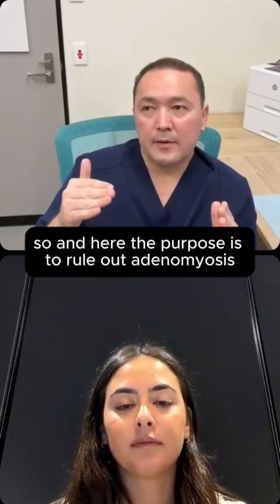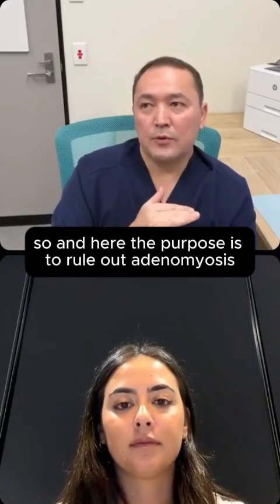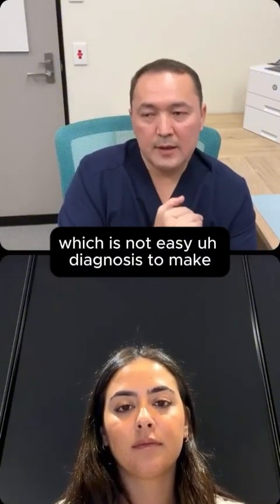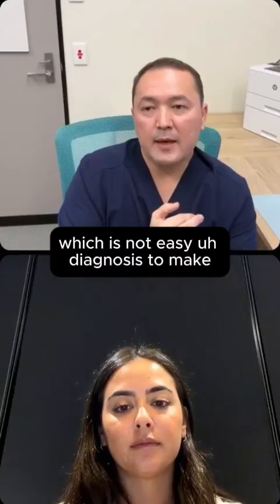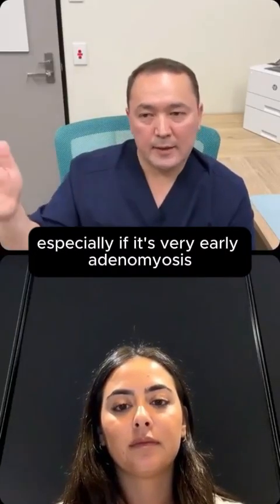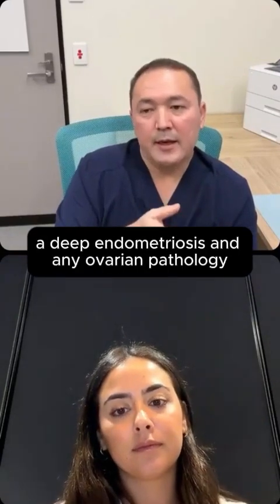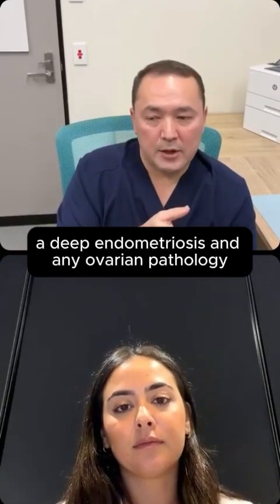Here the purpose is to rule out adenomyosis, which is not an easy diagnosis to make, especially if it's very early adenomyosis, deep endometriosis, and any ovarian pathology.